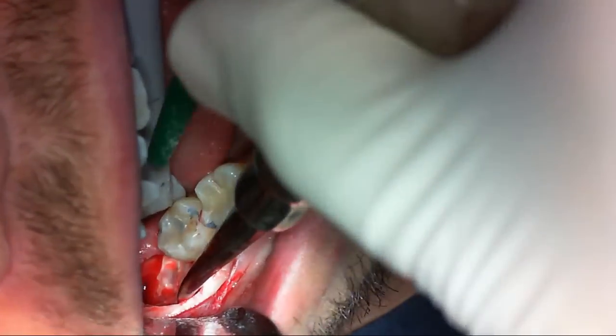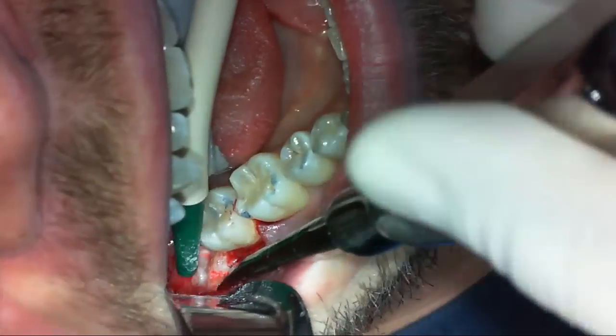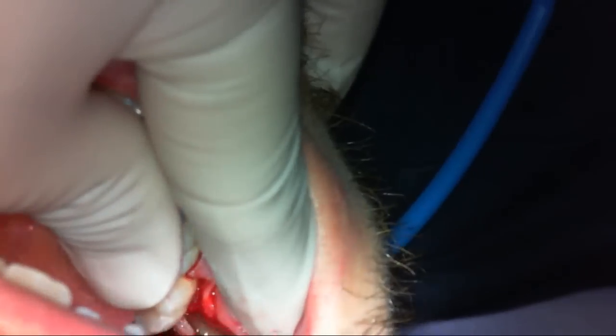Now I'm lifting the mesial root. Initially I'm working from the front of the patient, but ideally I need to move behind the patient for better access — so I can get my elevator under the mesial part of the crown and elevate the root distally. I prefer luxators because of their narrow tips, which let me engage much more easily under the roots and crown, though some surgeons prefer couplands due to their flat end, which carries less risk of injuring the floor of the mouth or tongue.